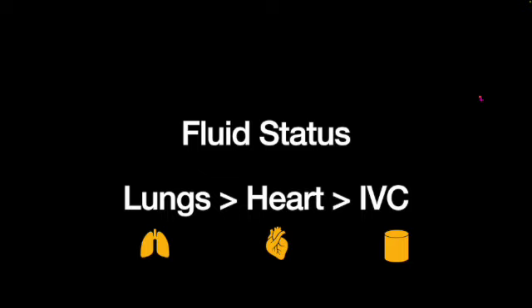Absolutely not. If the lungs are nice and dry, then I take a look at the heart. Is there systolic dysfunction? Is there something else going on? Then I look at the IVC.